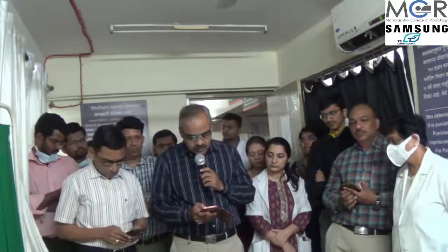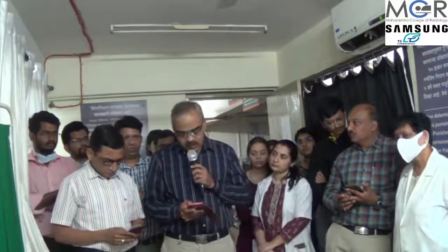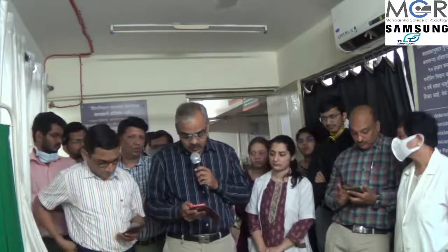There is a question: how can we suspect presence of deep pelvic endometriosis in a patient on transabdominal ultrasound and go ahead with TVS? Or should any case with dysmenorrhea, dyspareunia or dysuria be evaluated with TVS? As everybody has said, it is always advisable to do a TVS in a pelvic ultrasound in addition to transabdominal. You may do a transabdominal ultrasound followed by TVS, but that is a must now as per all these guidelines and current protocols. I think most of the questions we have done with.